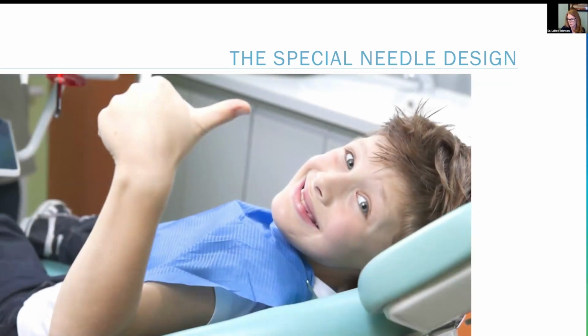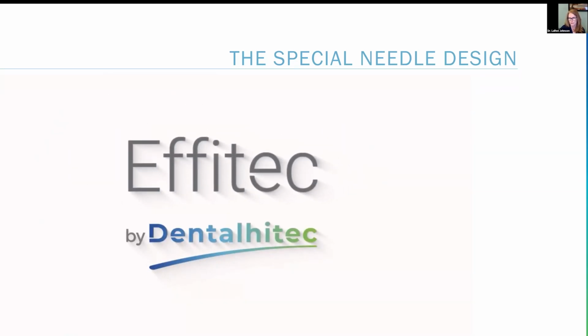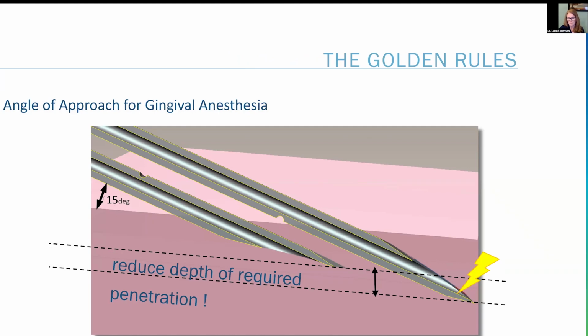And that makes it possible for you to pop through it without any discomfort. And then once we're in the trabeculated bone, that is where there's only pressure sensors, and that makes it a virtually pain-free injection.